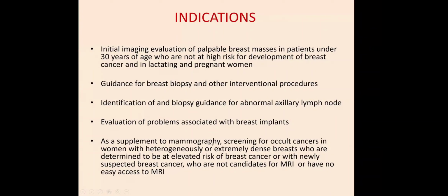And as a supplement to mammography for screening of occult cancer in women who have heterogeneously or extremely dense breasts, who are determined to be at elevated risk of breast cancer or with newly suspected breast cancer, or who are not candidates for MRI or have no easy access to MRI. Actually, I have written this because these are what the ACR guidelines state, it's the entire statement. But in crux, this means that if you have a young individual with a high risk of breast cancer, or the mammography is going to be a dense breast, then in that case, you should use ultrasound as a complementary screening tool for occult cancer, especially when she can't undergo MRI.